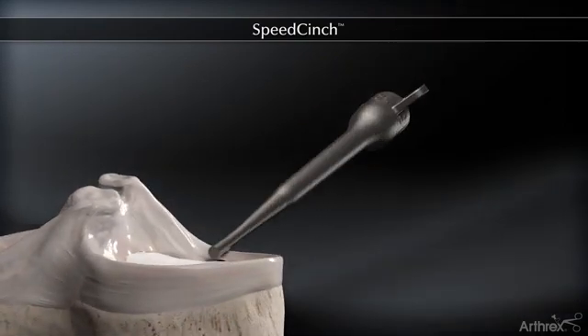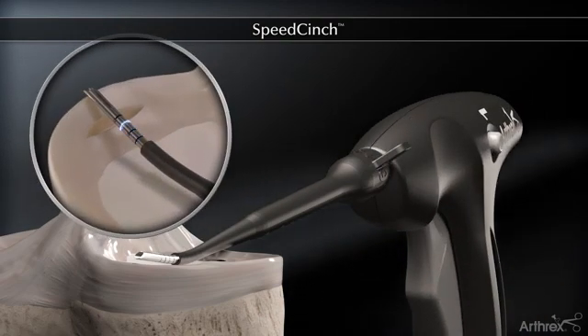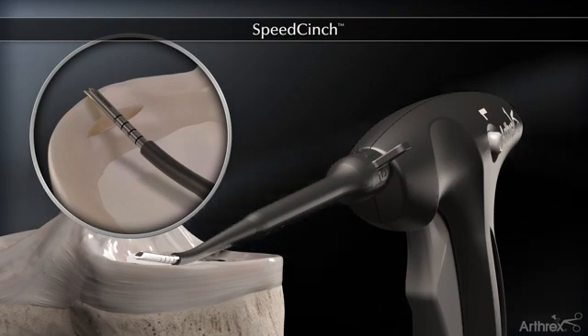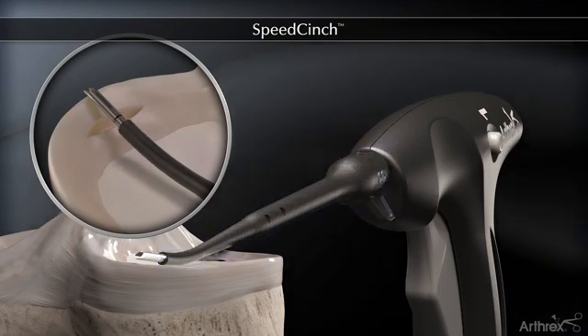The adjustable depth stop can be used as a cannula to facilitate passage into the joint. The meniscus is measured using the laser lines on the tip of the Speed Cinch needle. The depth stop is set according to the measurement by rotating to the desired depth with the desired number facing up.